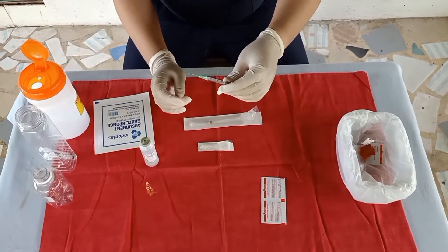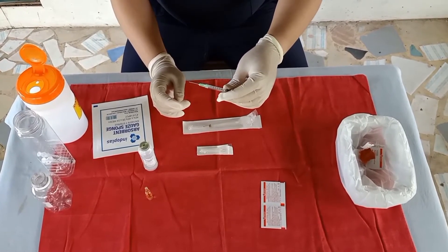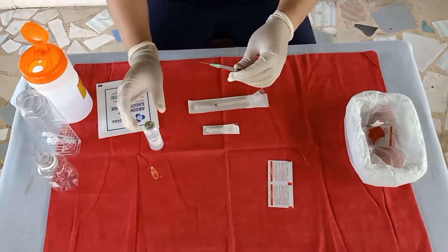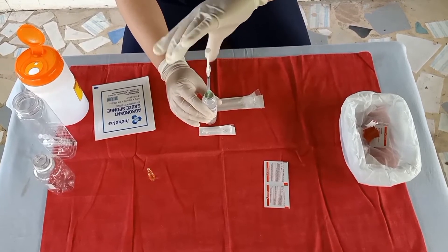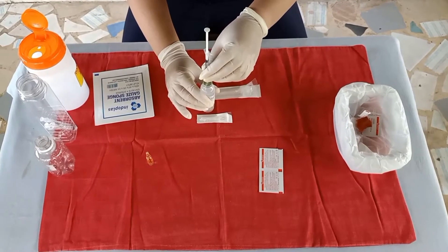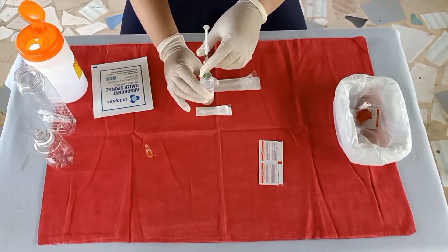Carefully insert the needle into the upright NSS vial through the center of the rubber cap, maintaining the sterility of the needle. Inject the air into the NSS vial, keeping the bevel of the needle above the surface of the NSS solution.